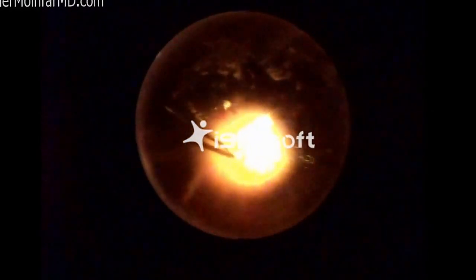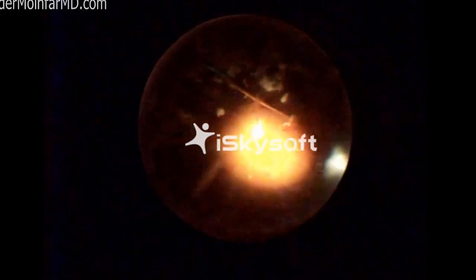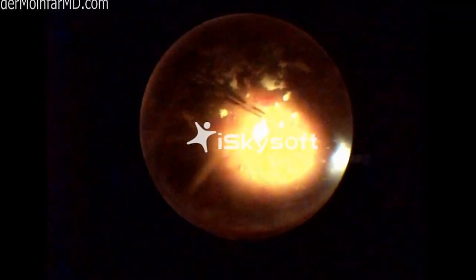I generally prefer to use air for a couple of reasons. One is that it creates what's called a minified view, and basically what that means is one can see farther out to the retinal periphery, allowing for more extensive laser treatment. But it also helps control any bleeding during the course of the surgery. And I generally tend to leave air inside the eye at the conclusion of the case. Many of us do that, although we're probably in a minority. The reason for that is that there's some evidence that it may reduce the risk of leakage from the wounds postoperatively. Now what I'm doing here is switching instruments, or sometimes switching hands. I'm right hand dominant, so sometimes to get to the other side I switch hands.